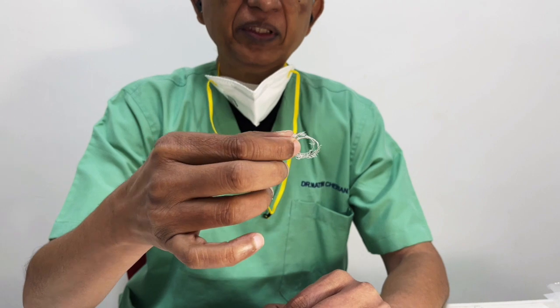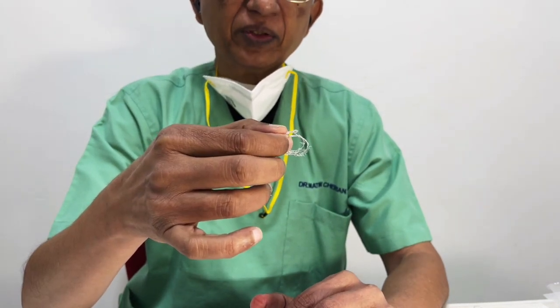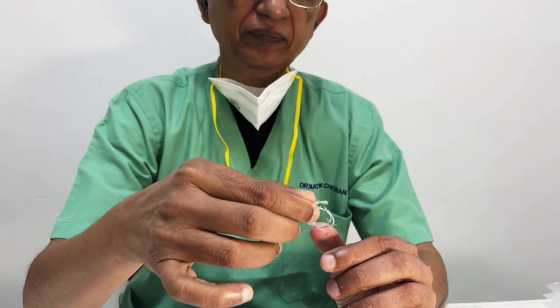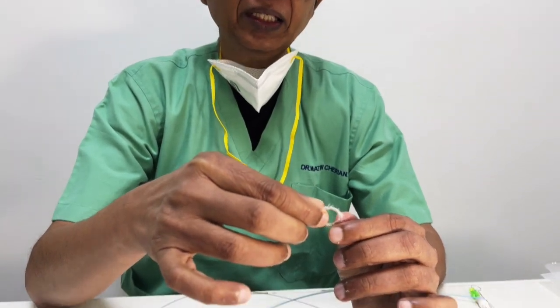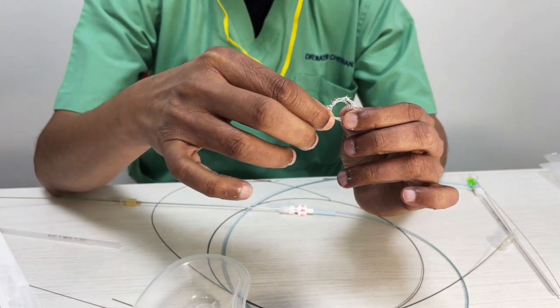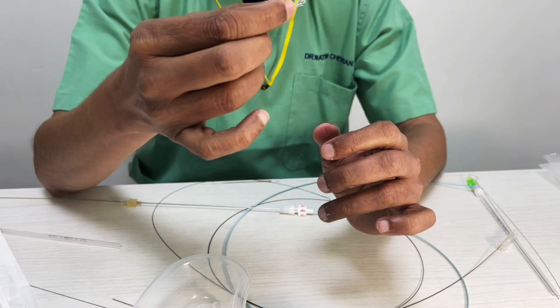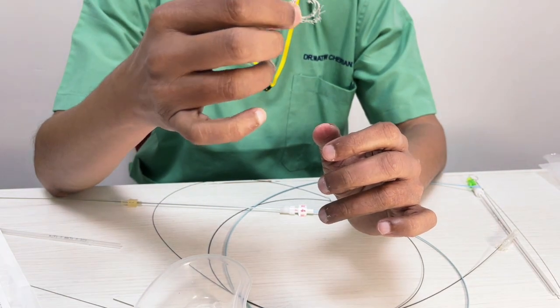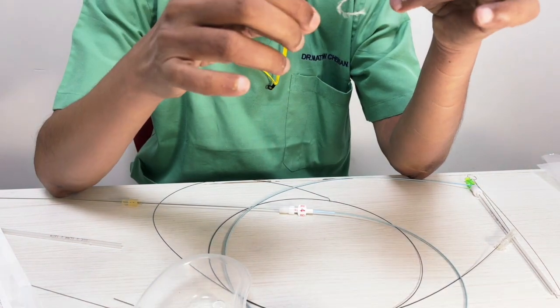So basically remember, this is a pushable coil. It goes through a diagnostic catheter. It's got fibers. Once you push it out, it will exit. But once you push it halfway out, you have to complete the procedure. There's no way that you can retrieve it again. And that's why you tend to use it in zones that are safe. But it's an excellent material for large vessel occlusion, right?